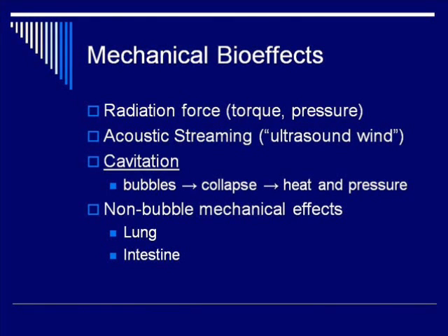Let's talk about mechanical bioeffects. There are four broad categories, of which I think one is very important and three are kind of marginal. The three marginal ones are radiation force, acoustic streaming, and non-bubble mechanical effects. Radiation force is essentially torque or pressure applied directly to the tissue from the force of the ultrasound.